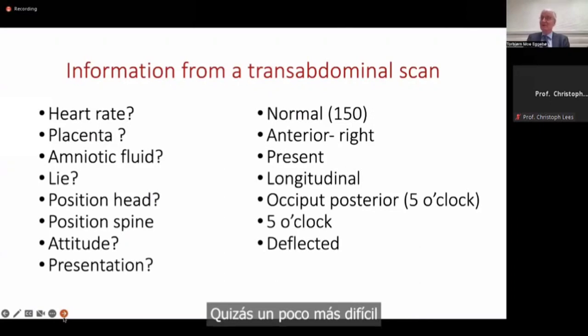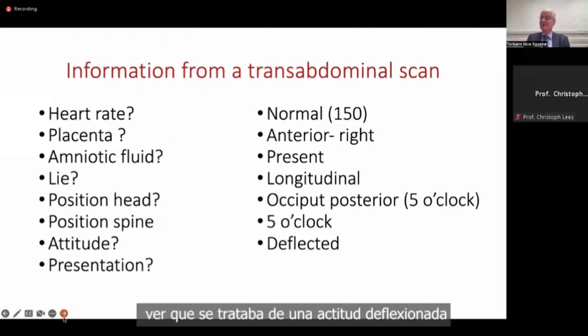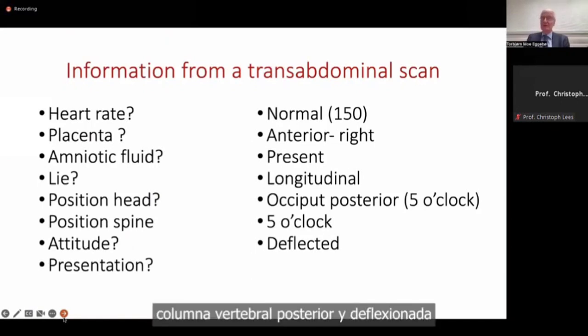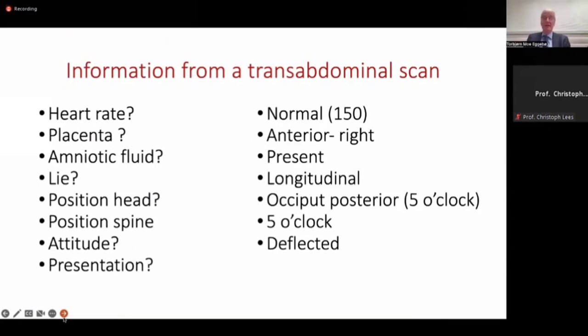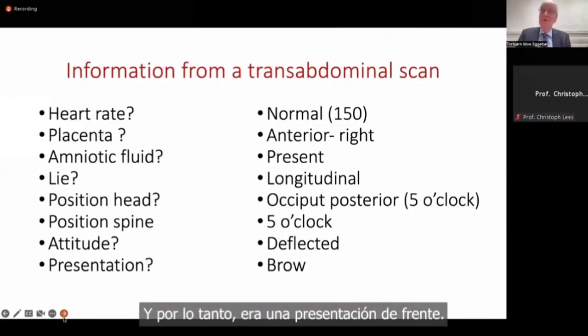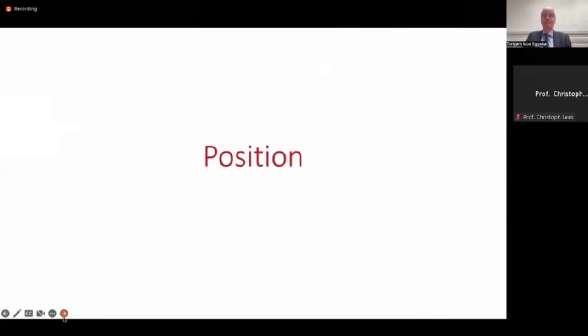Perhaps a bit more challenging to see that this was a deflected attitude. You could see the spine posterior and deflected, and you could still see the fetal eyes above the symphysis pubis, and therefore it was a brow presentation.